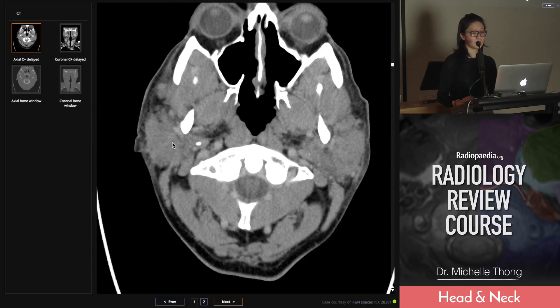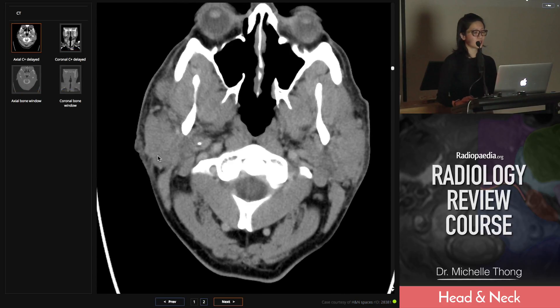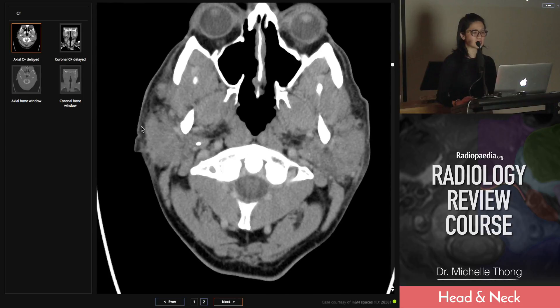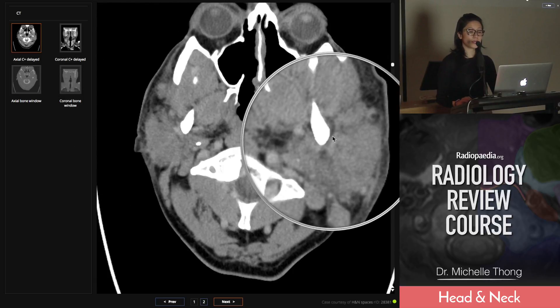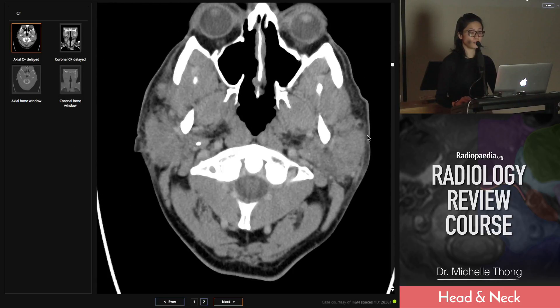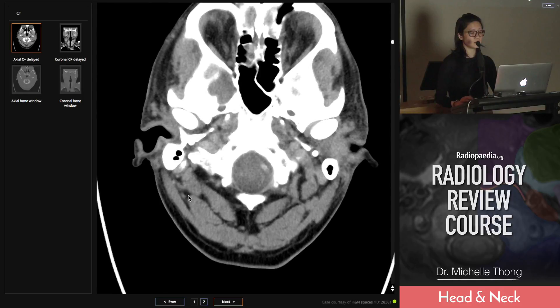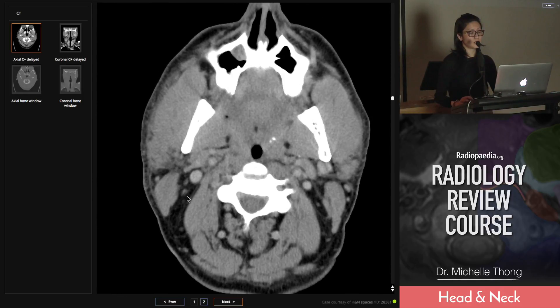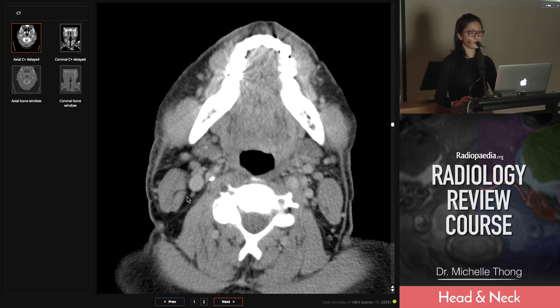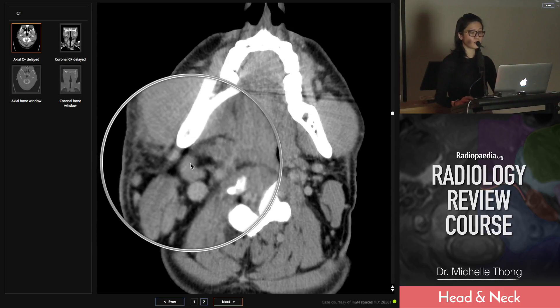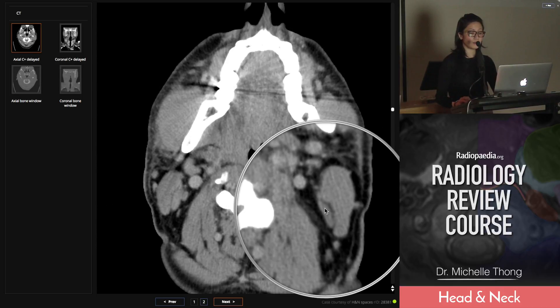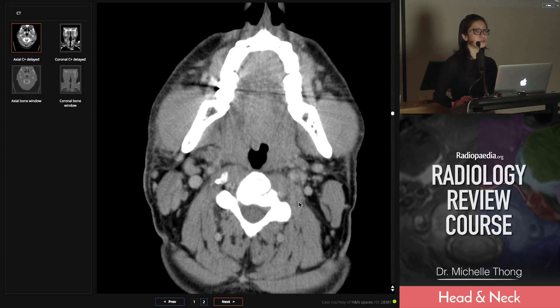This is a CT. You get the impression the parotid glands look abnormal — they're kind of indistinct in their margins, the fat is very stranded. You can see that's all very dirty-looking fat, but again bilateral and symmetrical. As you come down, you get the impression — look — are the nodes normal or abnormal? There are lots of little prominent nodes. They're too easy to find. And I have a rule: if a junior registrar finds nodes too easily, they're abnormal.